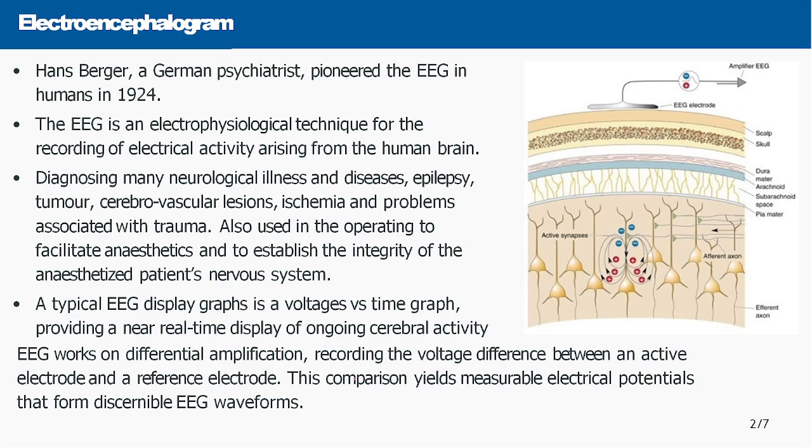We know that the gray matter and white matter contain numerous neurons, and these neurons have excitation and action potentials are generated. These action potentials generated in the gray matter and white matter travel, and these changes of electrical activity we need to capture through surface electrodes placed on the scalp.